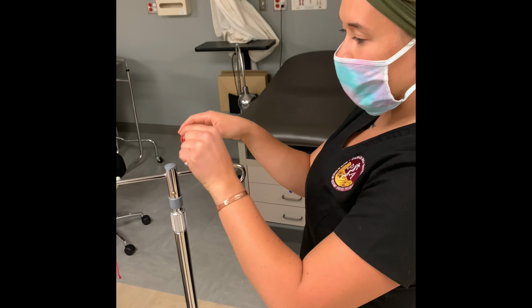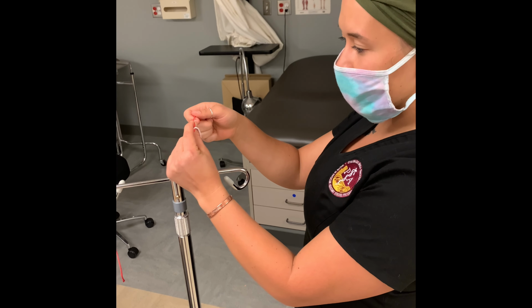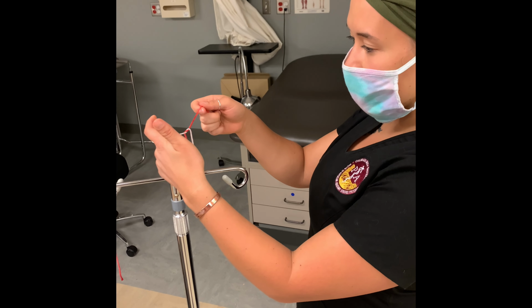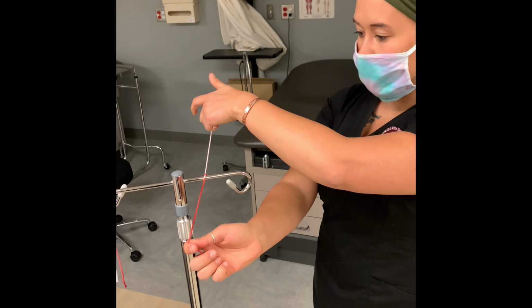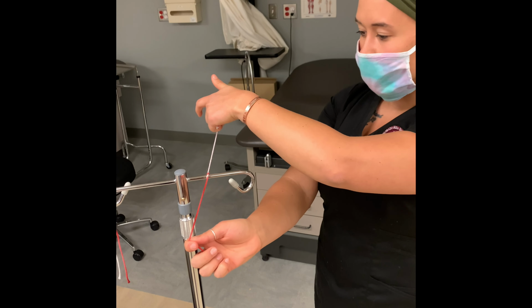Pivot left wrist and bring one rope up through the loop created. With your right hand, grab the right strand and tie the knot down. Cross your hands so the knot will lie flat.